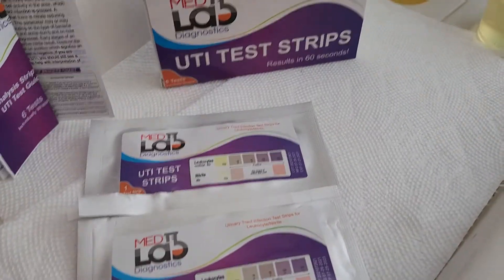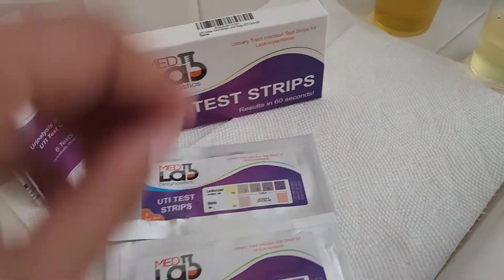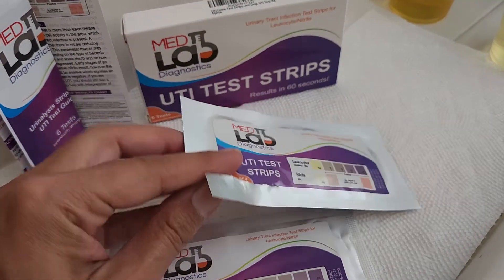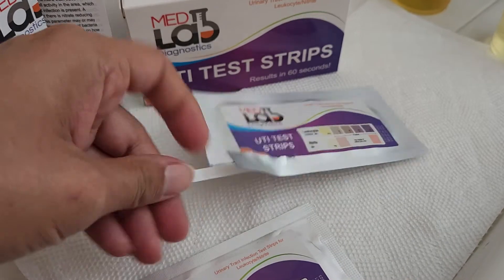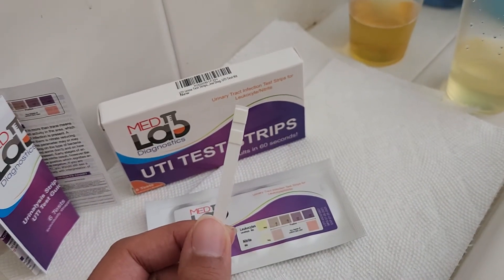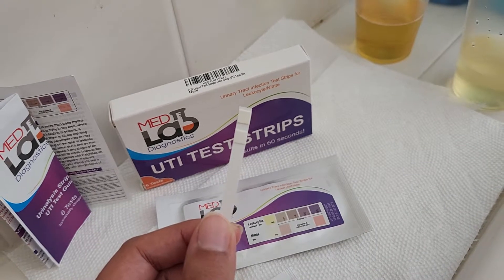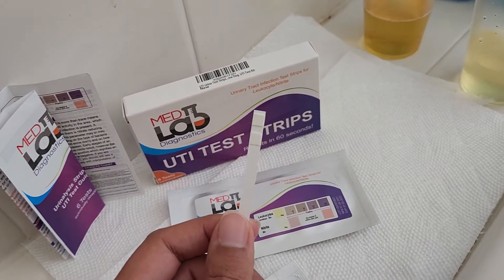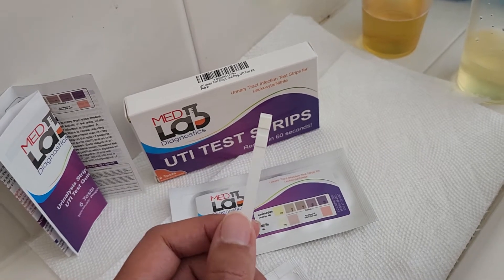So today we're going to test a couple of urines and see what we get for results. We will take the first test strip out of the pouch and the first thing you want to do when you are taking these out is check and make sure that the test strip is perfectly white. It should be like a bone white color when you first take it out, because you want to make sure that the strip has not gone bad.